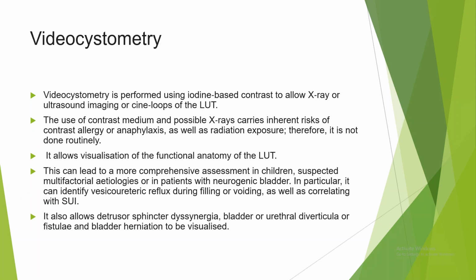Now, video cystometry. What we do in video cystometry is they see the same graph as urodynamics, but along with that, they take fluoroscopic X-rays with contrast medium, iodine-based contrast. So there is risk of allergy and risk of radiation exposure in video cystometry, so this is not done routinely. And it will give us an idea of the lower urinary tract anatomy also. It is more useful for the diagnosis of bladder diverticulum, urethral diverticulum, and if any leak is there. While doing the filling graph, we can see if there is any leak.